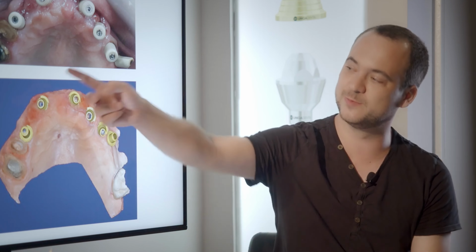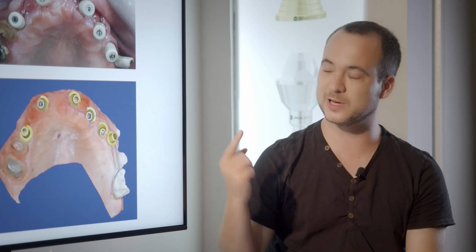If you use angulated multi-units, each type of angulated multi-unit has 6 positions. So here, of those 5 angulated multi-units, only one was taken with implant level scan abutment. If we took all 5, you have 5 times 6 positions. 30.